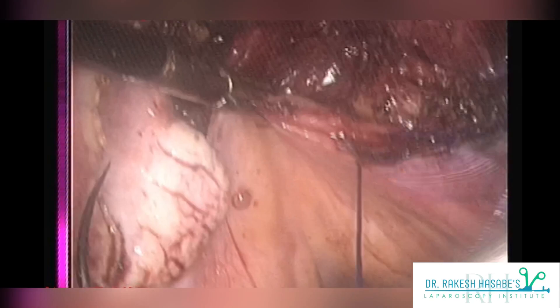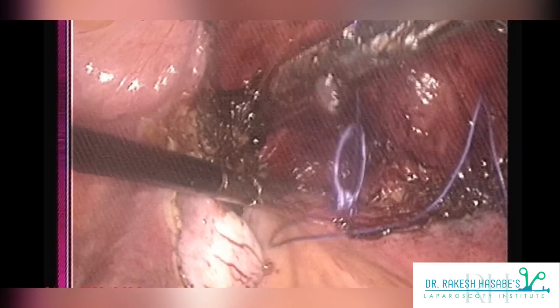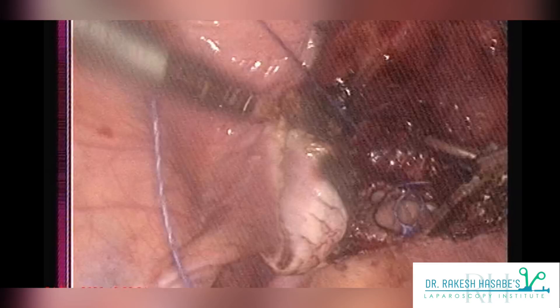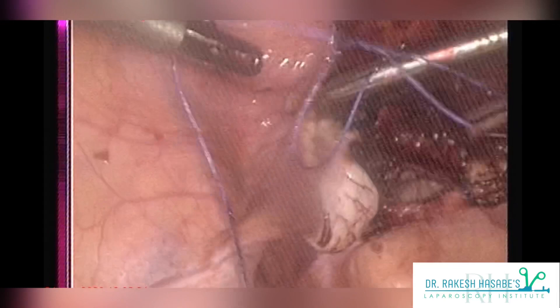Always keep in mind while performing vault closure that you have to close the vault but also prevent future vault prolapse. To prevent future vault prolapse, you should include the uterosacral ligaments into your vault closure. Anteriorly, the paracervical fascia should also be involved in your vault suture. Here you can clearly see my first bite has included the right-sided uterosacral ligament, and now I am tightening the knot.